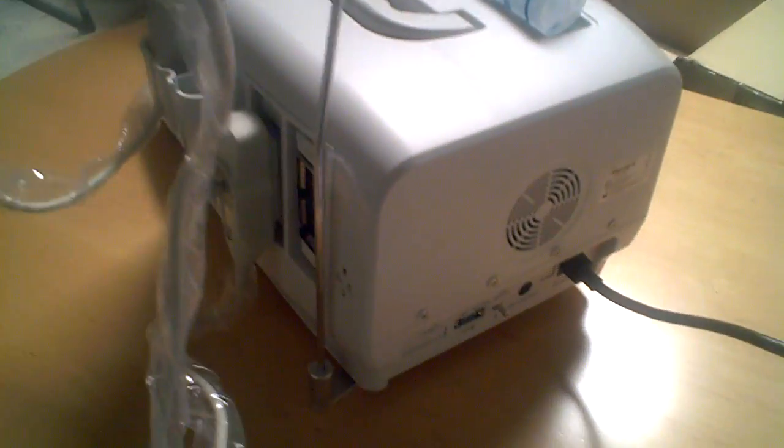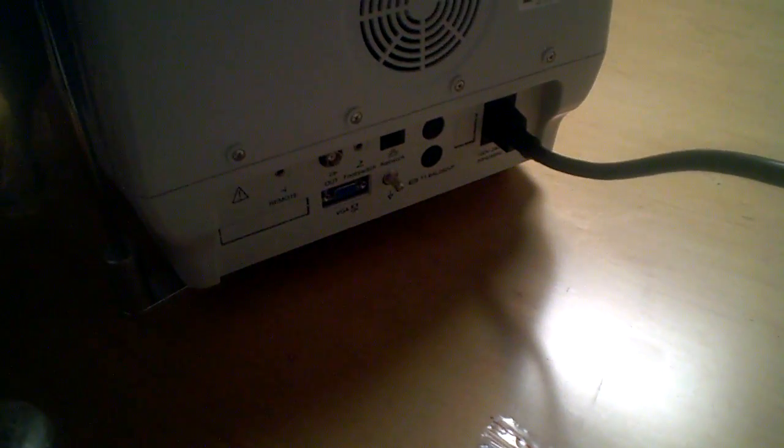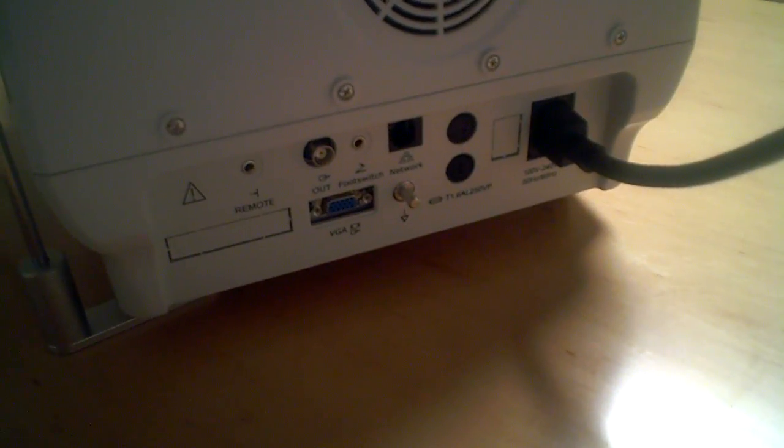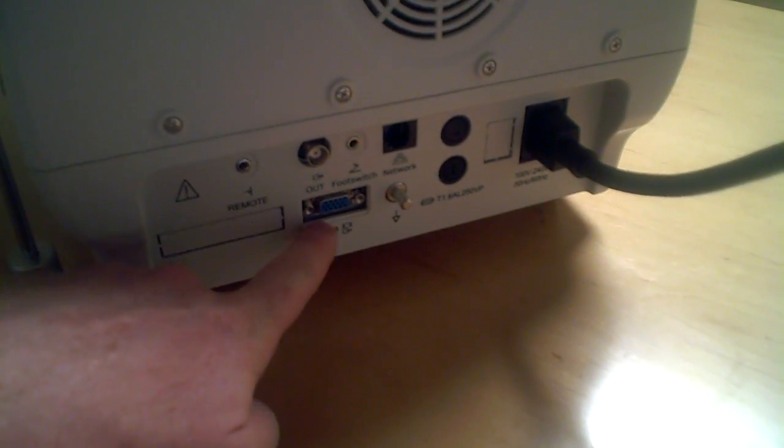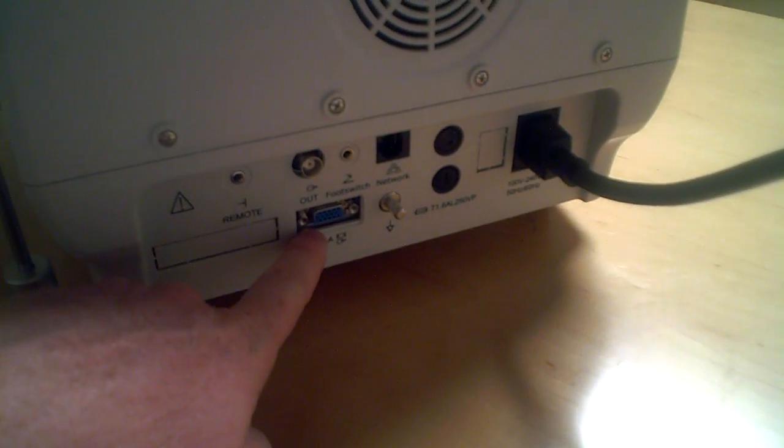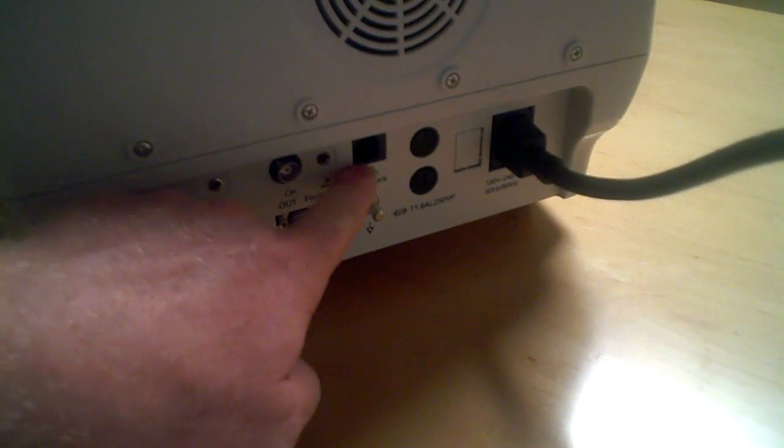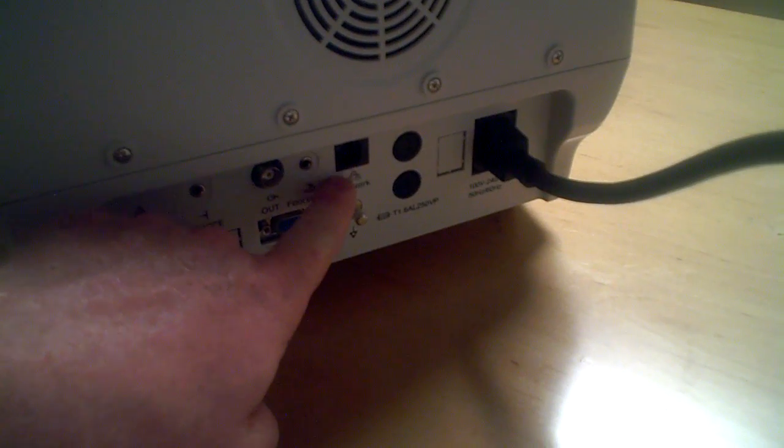As we pan around to the back side, you can see the network capability. It does have a VGA hookup for a screen. It enables you to network.